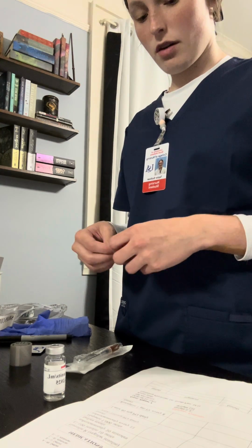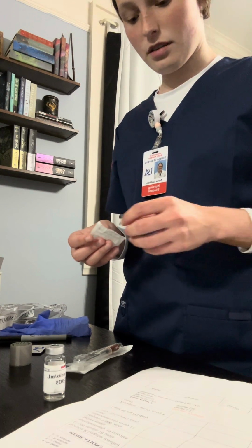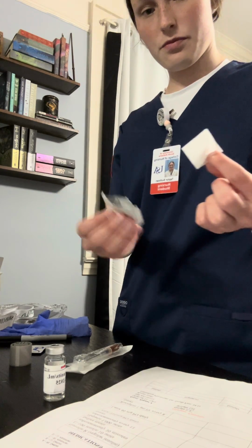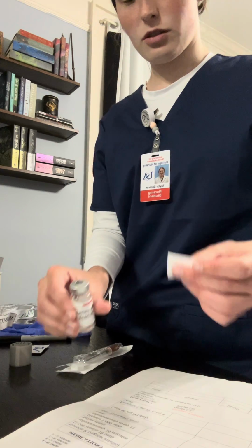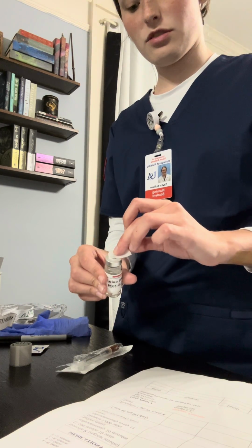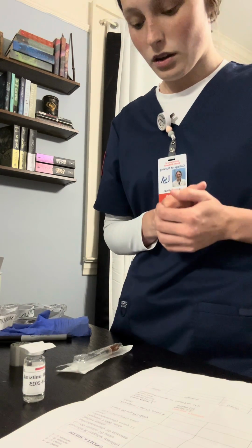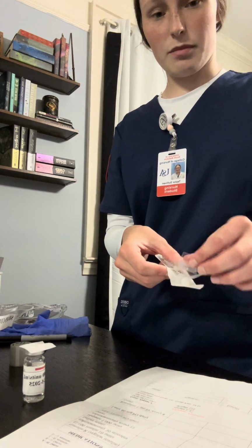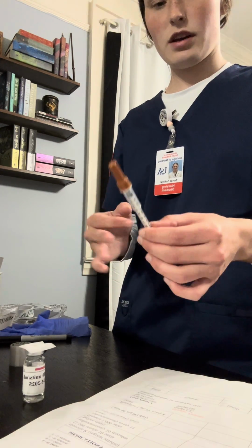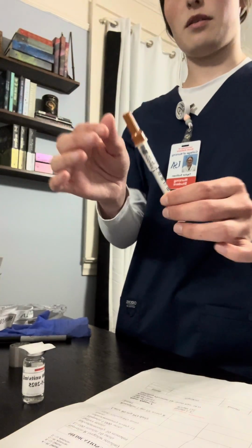So before I draw up any medication, I'm just going to set this aside. I'm going to clean the vial. So I'm going to start from the center and then work my way to the edge or the rims, and then I'm just going to set that down. I'm going to take my tuberculin syringe. I'm going to set this aside as well, just to show that it's tuberculin.